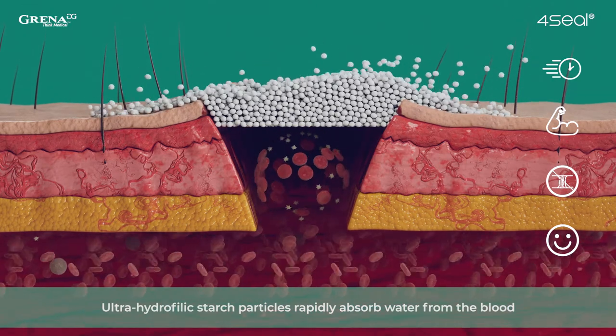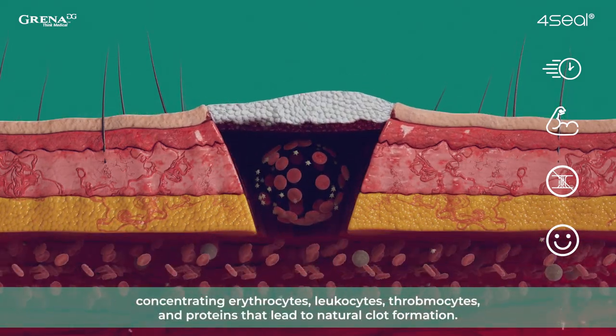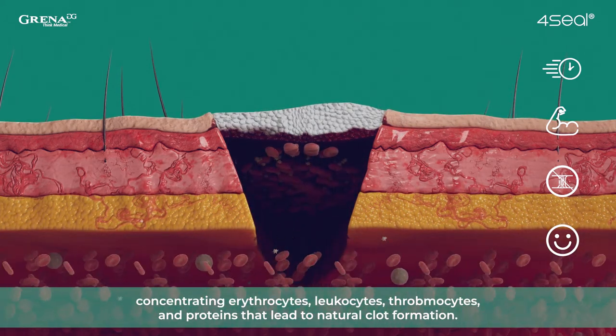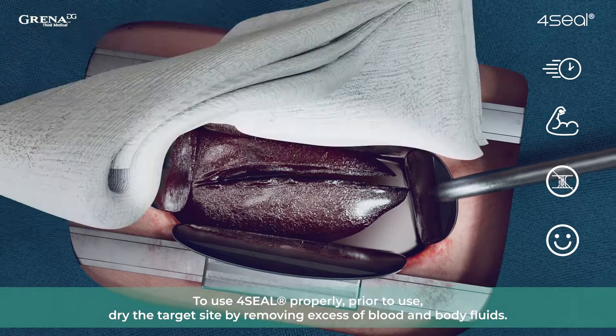Ultrahydrophilic starch particles rapidly absorb water from the blood, concentrating erythrocytes, leukocytes, thrombocytes, and proteins that lead to natural clot formation.